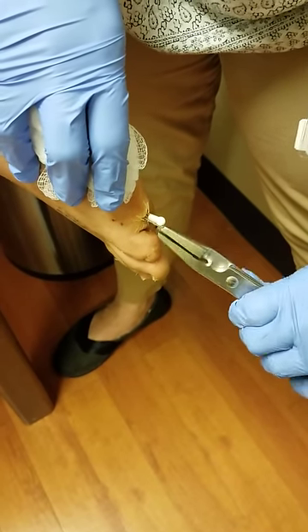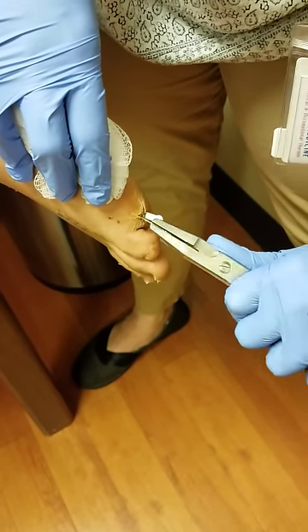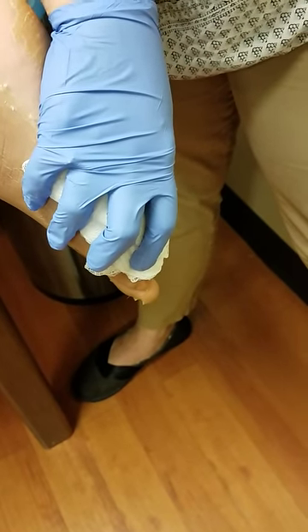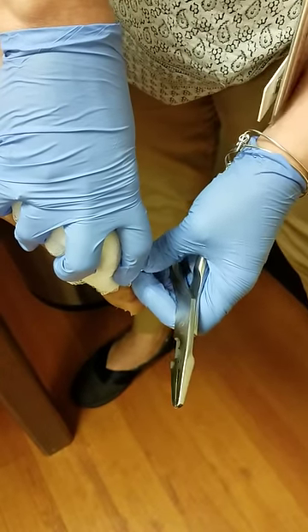That's the worst ones. I hate sand spurs. But when it comes out, it feels so good, and she's almost got it. That's the little toe — that's the worst one that had two in the same toe. Bam. It's gone, girl. You all right? That's one, and that's the worst one. See? It's strong.